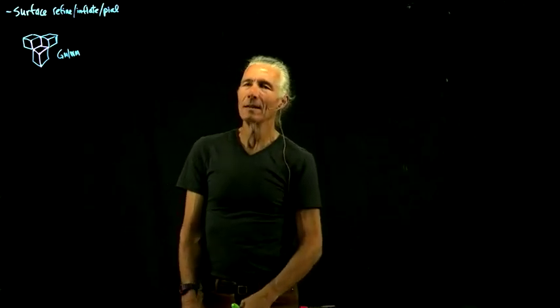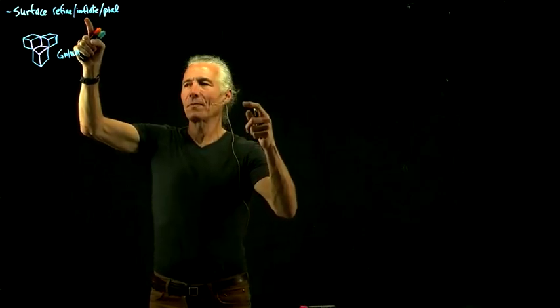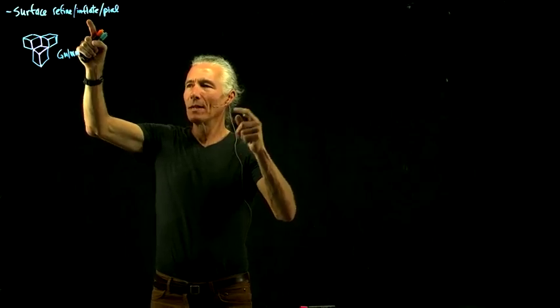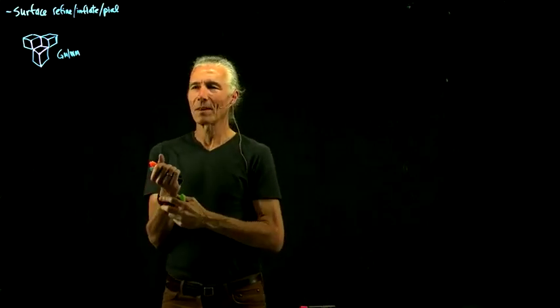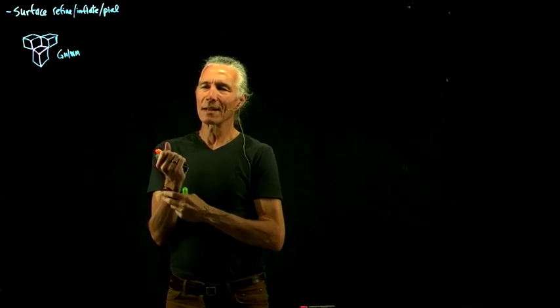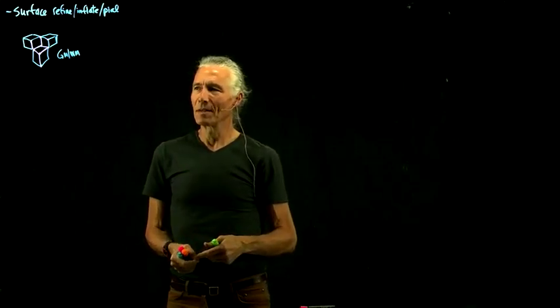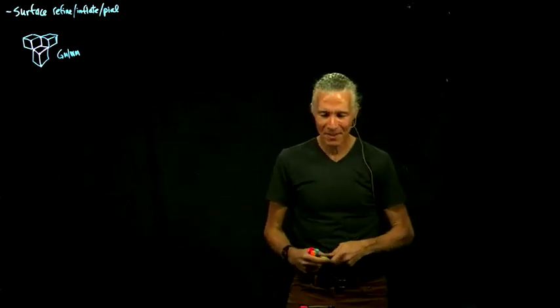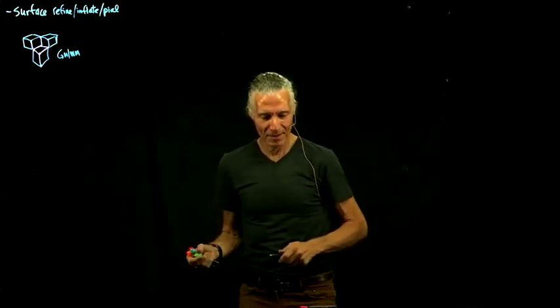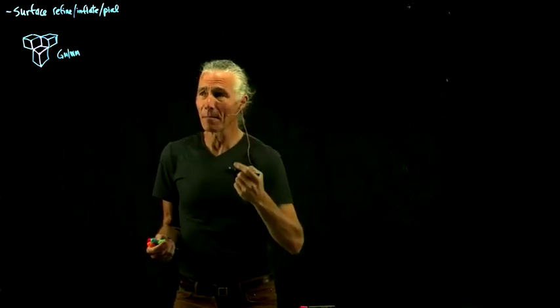And then finally, we want to refine it against data. Are we in the right part of the gray matter? Are we at the gray-white matter border? So we define an error in those 3 things. And then we take the derivative of it, and the derivative tells us how to minimize it. And I'll make a spatial diagram of that. We'll end up with the same thing as we already came up with, but that's the proper way to describe it. And so here's the total error, and the total error is just a single number.